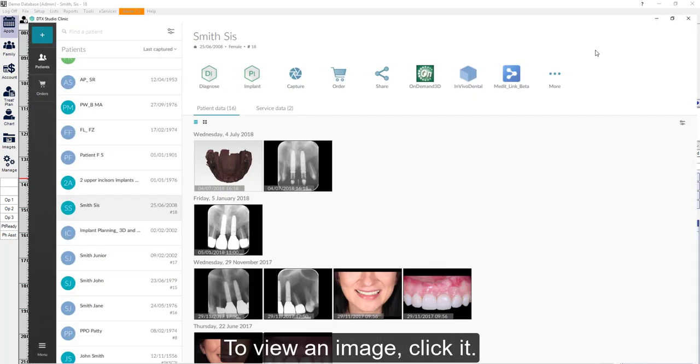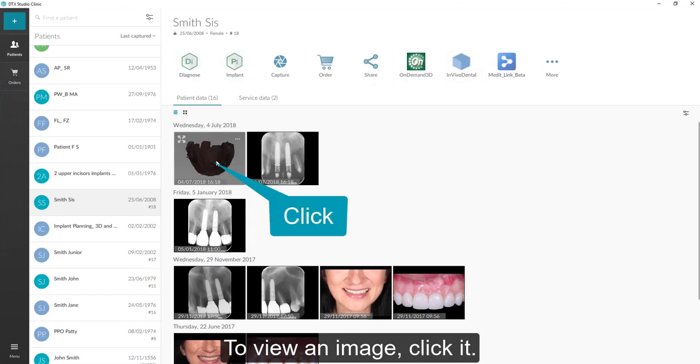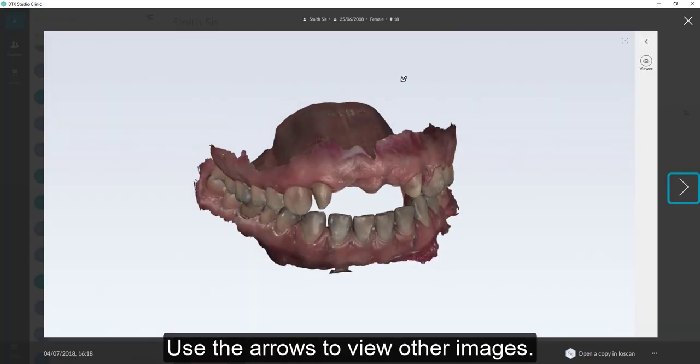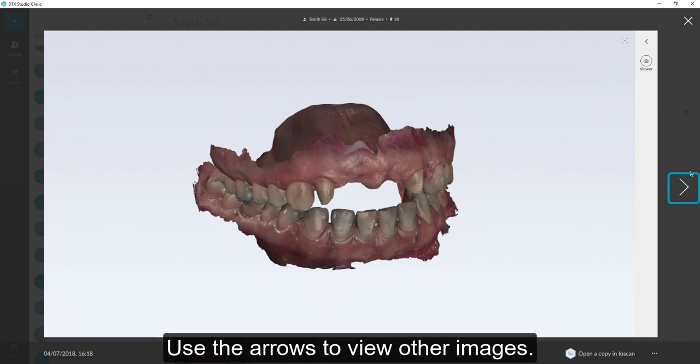To view an image, click it. To view other images for this patient, use the arrows.